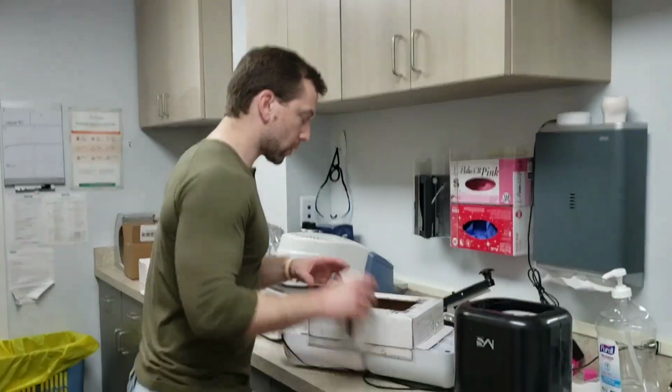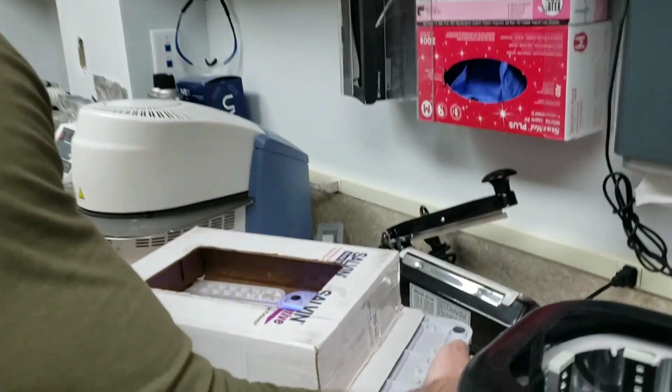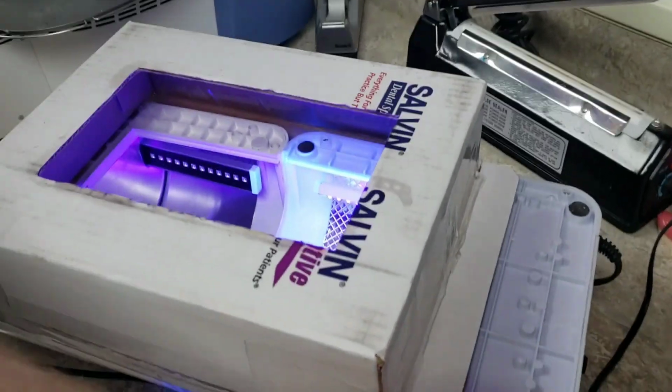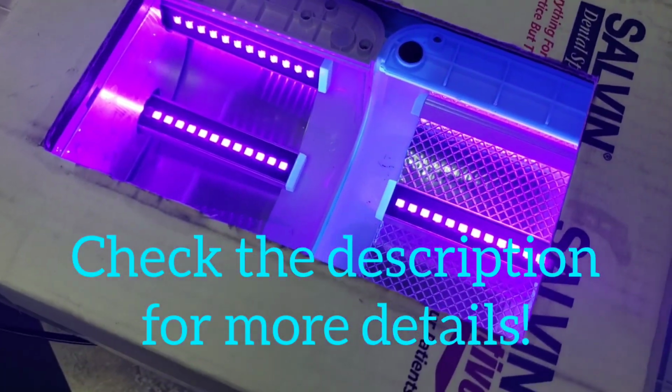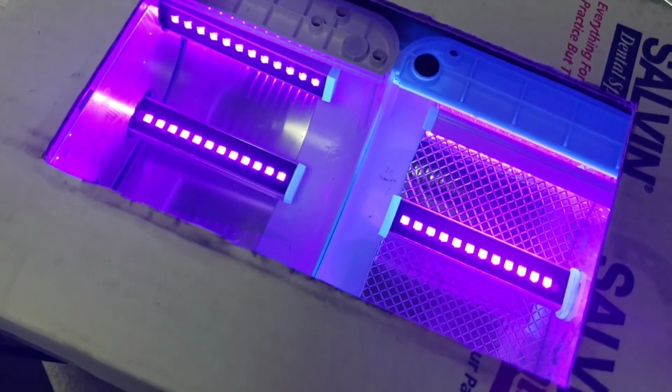Okay, so one more thing. Come on over here. I just want to show you what they look like when they're on. I don't know that anyone really cares, but yeah, you can see the blue light that's emitted. So anyway, that's it.